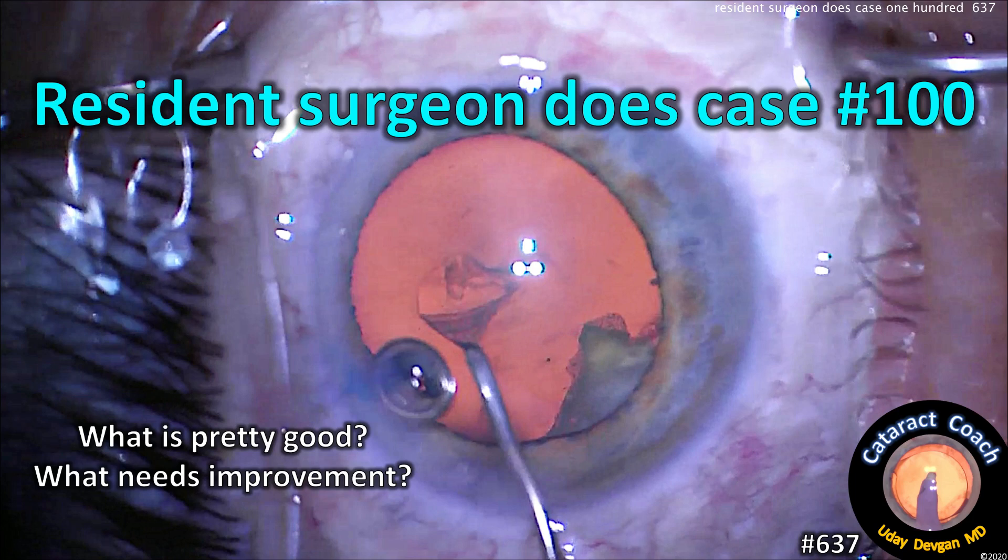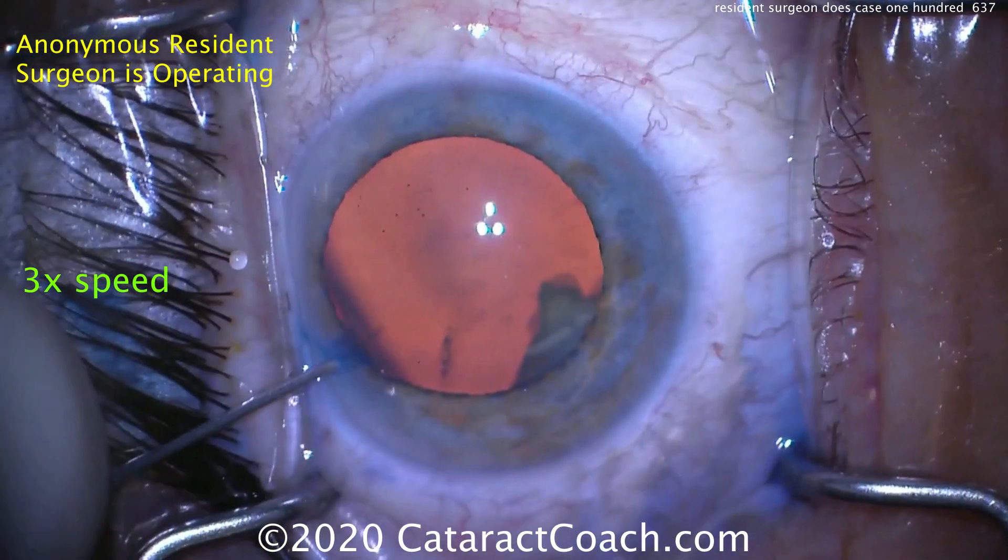CataractCoach.com. A resident surgeon does case number 100. What's pretty good and what needs improvement. Let's watch.